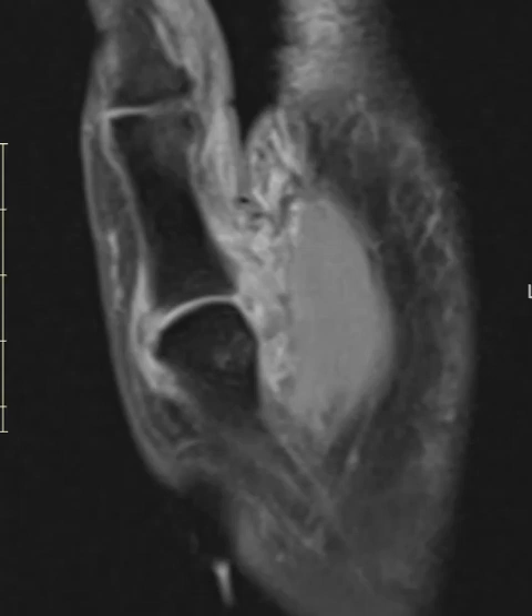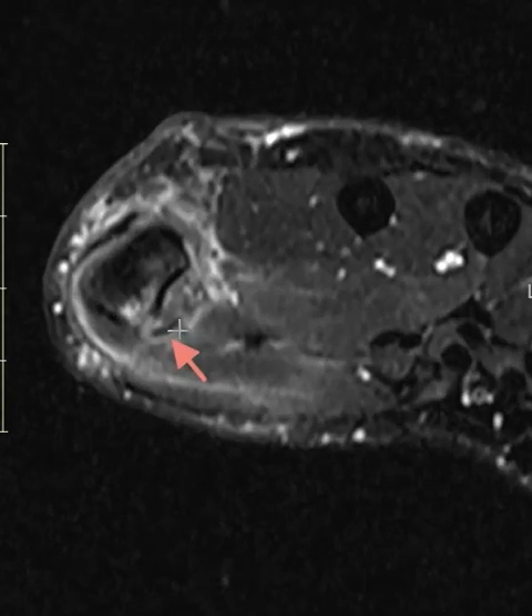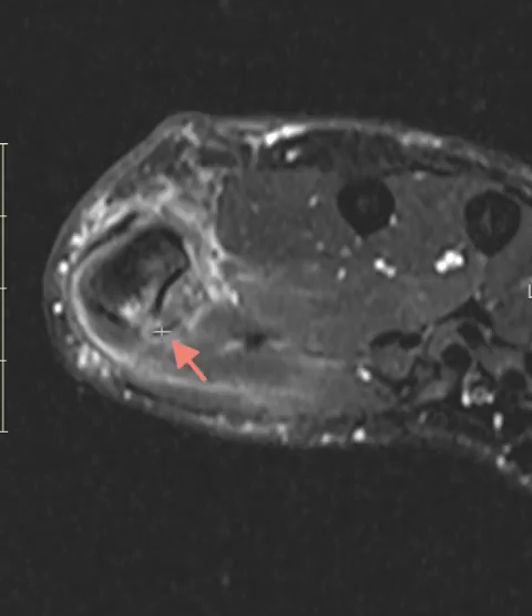There's another finding we can see on these short-axis images. Here are the thenar muscles, and they're strained and edematous. There's an arrow indicating a little cortical avulsion fragment — it looks like a little smile. The donor site is right here, and there's some patchy marrow edema. This is a cortical chip fracture or avulsion fracture which is retracted back — one of the thenar muscles attached here and pulled off.